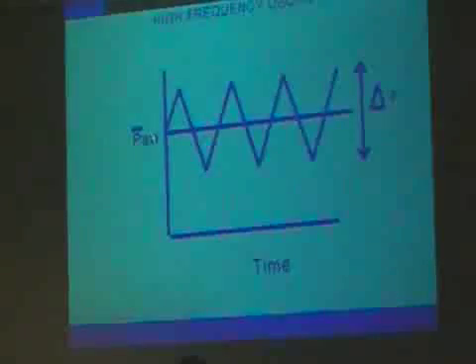The mean airway pressure, the straight line going across, all right, is set. I want a mean airway pressure of 10. I want a mean airway pressure of 12. It's a pressure that is set by the operator. And of course, it needs to be whatever is needed to keep the lung optimally open. Open lung volume strategy. Somebody had a question about that at the end of the talk last time. It's the same thing. Open lung strategy, optimal lung volume strategy, means you're keeping the lung open, it is not atelectatic, and it is not collapsed, and it is not overdistended.